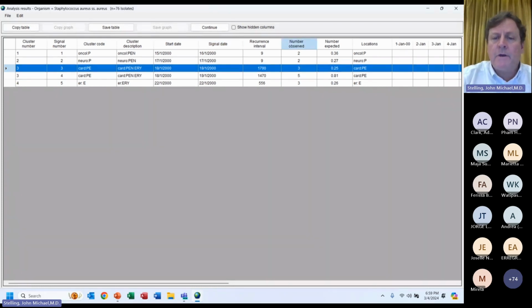It found the cluster on January 18th when the cluster had 3 people. It found the cluster again 1 day later with 2 additional people. So the number of people has gone up. So it's the same cluster, it's cluster number 3, but it found this cluster a few times. So that's very interesting because it's related to also your ability to intervene.